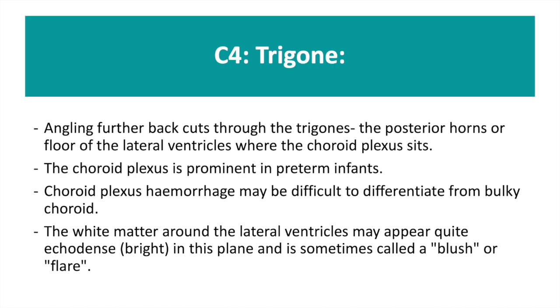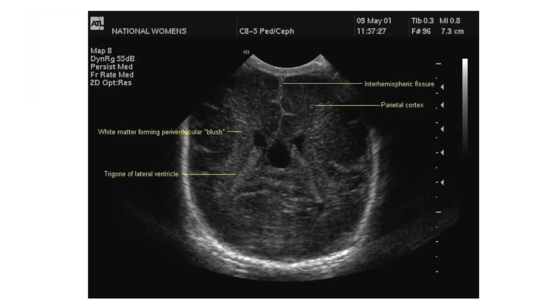C4 is the image through the trigones. This is the posterior horn or the floor of the lateral ventricles, and here is where the choroid plexus sits. A small choroid plexus haemorrhage can be difficult to differentiate from a bulky choroid.